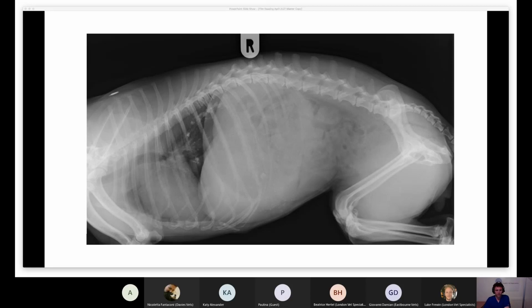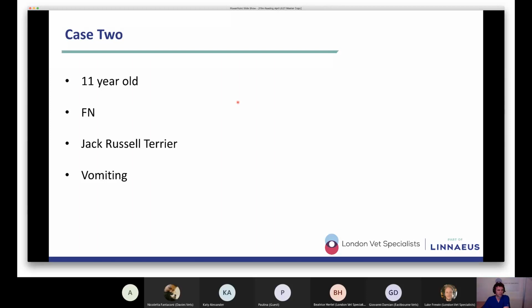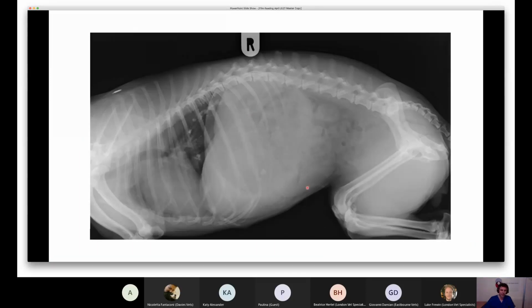And there is no pressure, because this little Jack Russell is not sat on the imaging table looking up at you guys, pleading with you to make a decision about what to do, and neither is this exam. I can have a go.